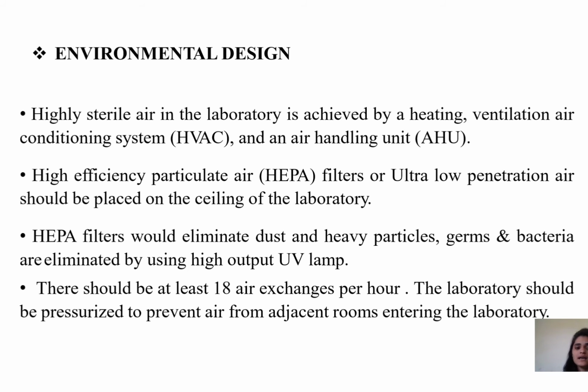Environmental designs. Highly sterile air in the laboratory is achieved by heating, ventilation, air condition system, that is HVAC, and AHU, air handling unit. Highly efficient particulate air HEPA filters or ultra low penetration air filters should be placed on the ceiling of the laboratory.